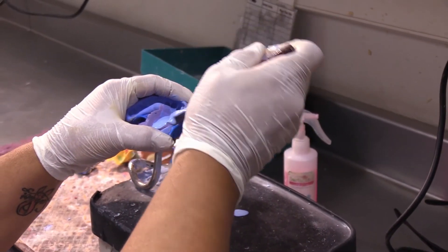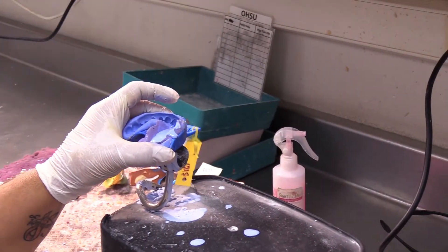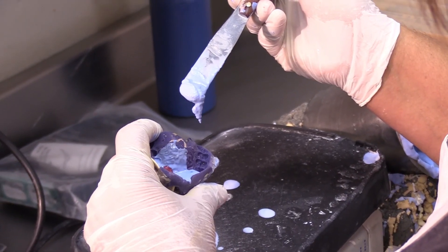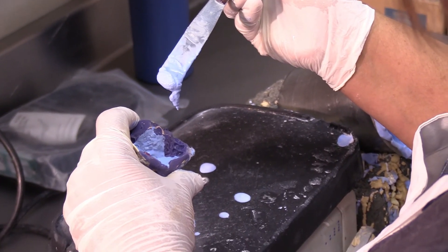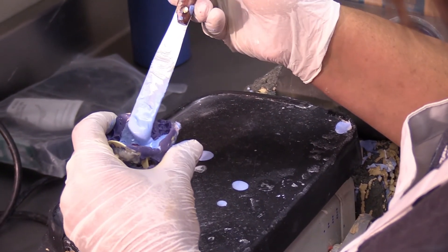To get good quality models, we use vibration tables when pouring the stone into the impression. That vibration allows the stone to easily flow into the impression while reducing the chance of creating voids in the model. Unfortunately, the vibration can also be strong enough to move the impression coping if sufficient retention doesn't exist.